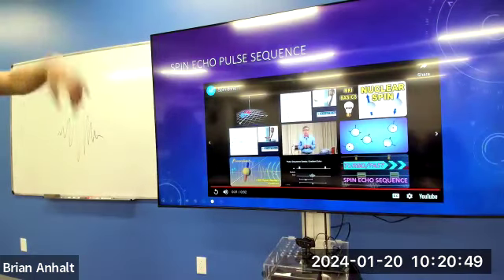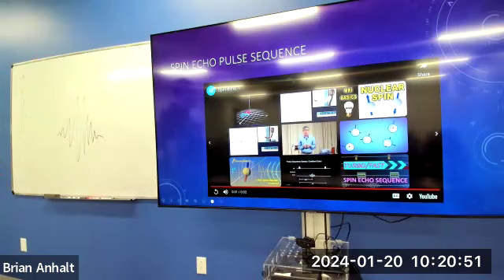We could actually do another 180 at that point, and have them come back together again. That's what I was gonna ask, can we just do it again? Yeah, we could do it again, and we do. But that signal is gonna decay even more. It's not gonna come back into phase as much because what is happening simultaneously?